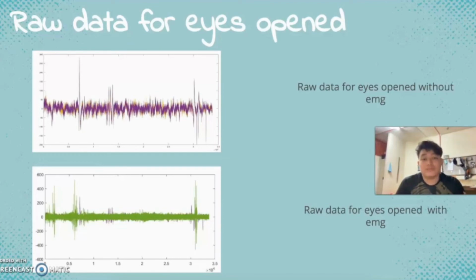For figure 9, which is the table below, it shows more artifacts than figure 8 because it has some additional artifacts such as the muscle from the forehead, jaw, or the eyelid muscle, as this muscle movement can cause artifacts by the moving of the electrodes. Furthermore, the movement of the eyelid may increase as the subject can see what is currently happening in the experiment room. Movement in the surroundings produces disturbance by altering the ambient electrical fields.